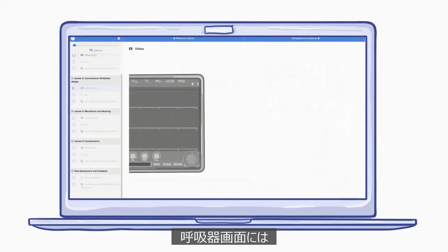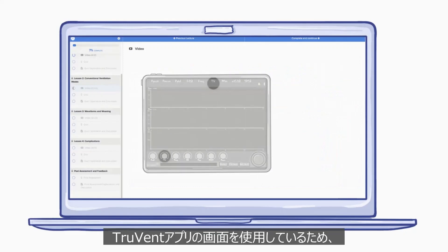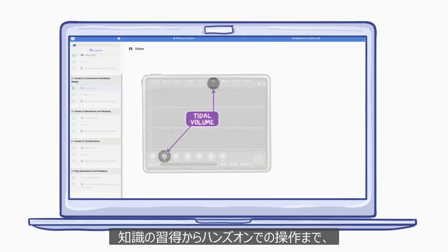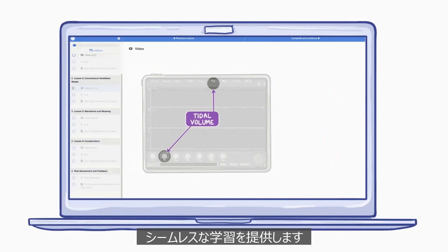The ventilator graphics mimic the user interface of the TruVent app, providing a seamless stepping stone from the initial introduction of the content to tactile practice with the supervision of an instructor.